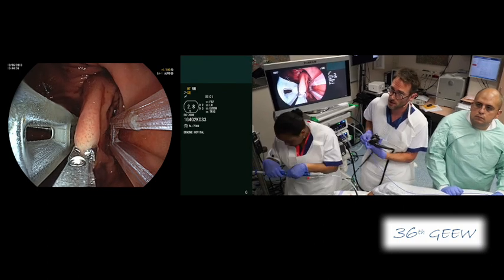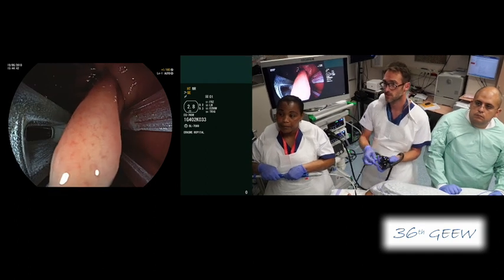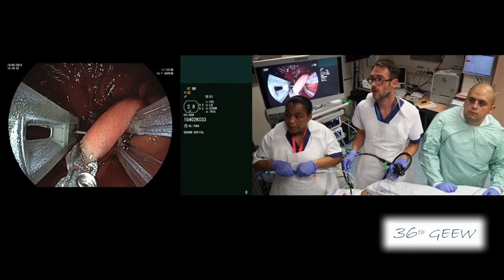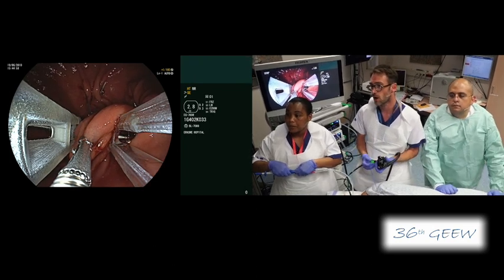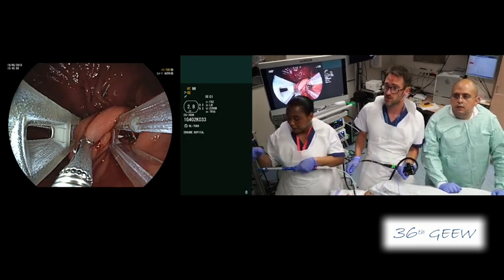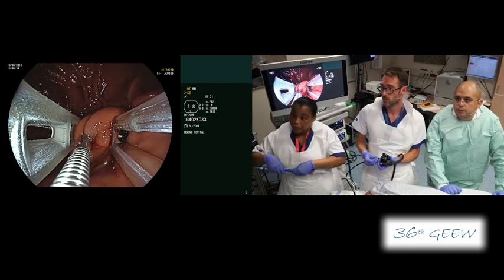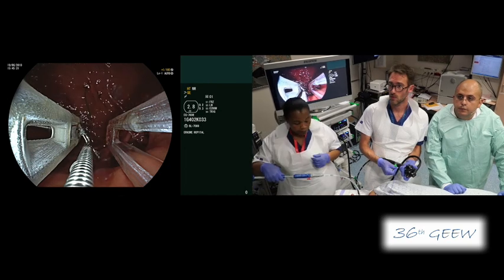You can see now I'm grasping the posterior wall and now she will pierce to release the second tag. It's interesting — it actually works if patients are conjunctively able to adjust their eating habits. That's why every patient should undergo a multidisciplinary workup before inclusion in any bariatric treatment — seeing a dietitian and a psychologist. This is not only for Endomina but for every procedure, even sleeve gastrectomy and bypass. We see nowadays patients gaining weight again after surgical procedures, so the combination of lifestyle modification and diet control with any procedure is mandatory.